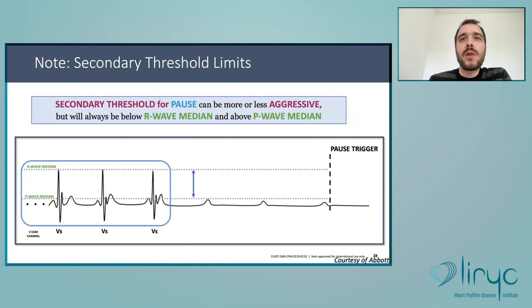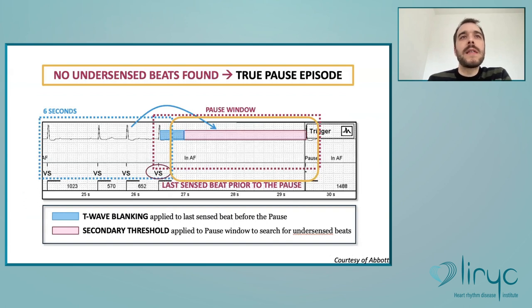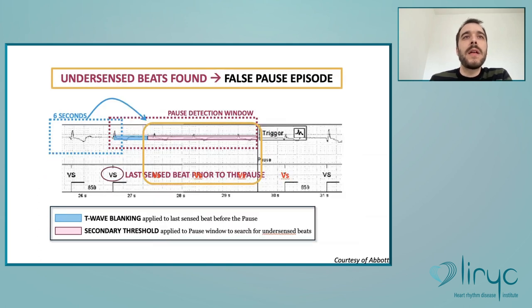The secondary threshold for pause can be more or less aggressive, but it will always be below the measured R wave median and above the P wave median. So in summary, this is another example of a true pause. The device calculates a secondary threshold and it looks for undersense beats. No undersense beats are found, so it's a true pause episode. For example, here it's an episode of false pause with intermittent undersensing that the device can detect with the secondary sensitivity threshold.